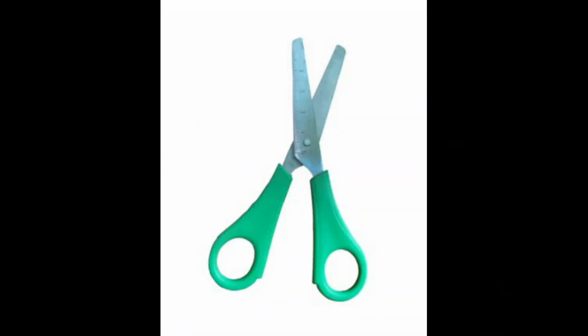Continue adding the power to neutralize the reflex, and then repeat the whole process for the second eye. Sometimes you may get a scissoring reflex. This is when two bands of reflex appear to move towards each other or away from each other, just like the scissors. This is usually seen in keratoconus and irregular astigmatism. At this point, you must be very sure which meridian you're dealing with. You have to look for the principal meridian. We will tackle this in another video.